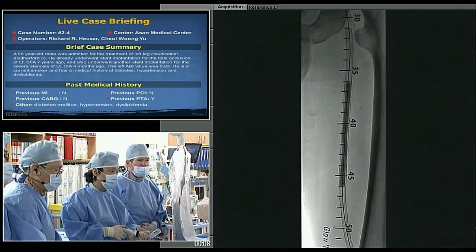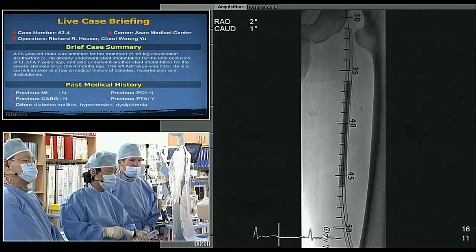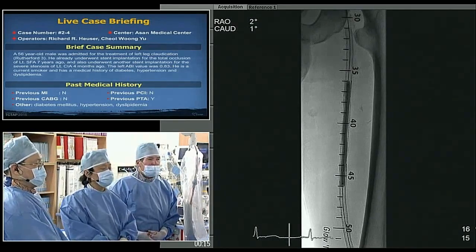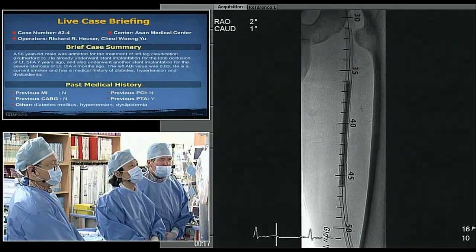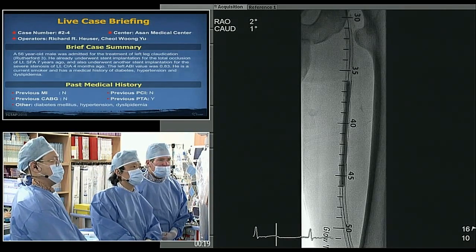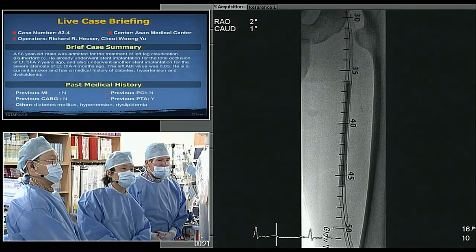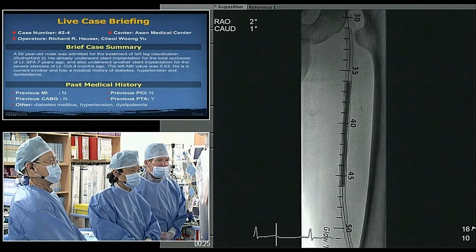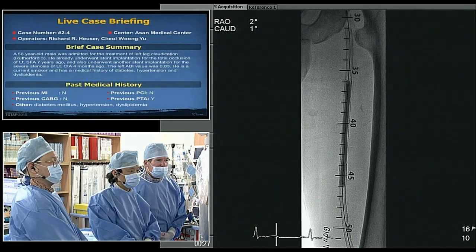Hello, this is Sven Braunlich from Leipzig, Germany. In this angiography, you see very nicely the gap between the stent edge and the balloon surface. This indicates all that material that you want to get rid of before ballooning.